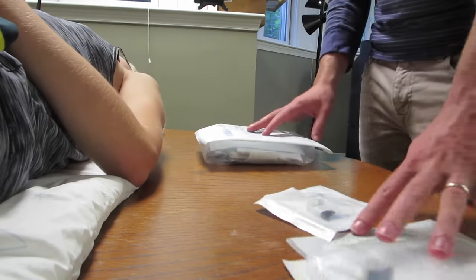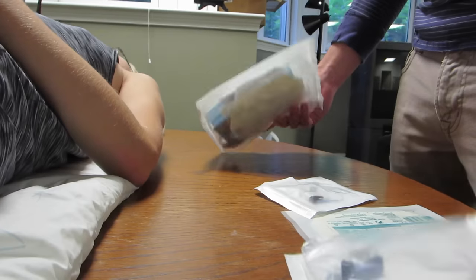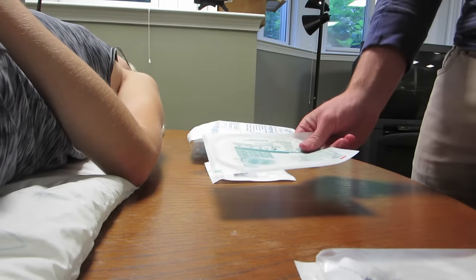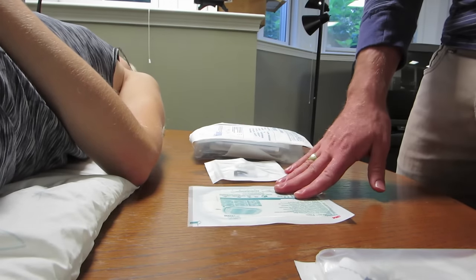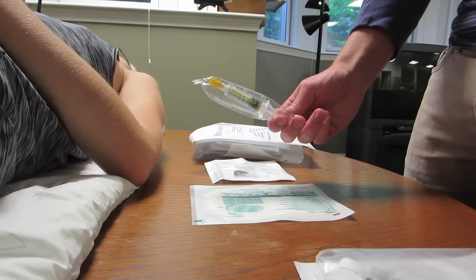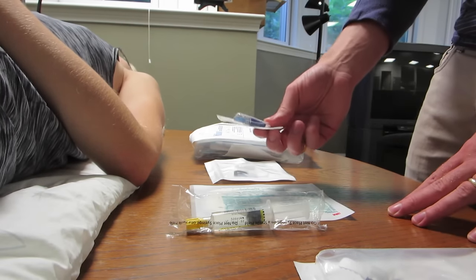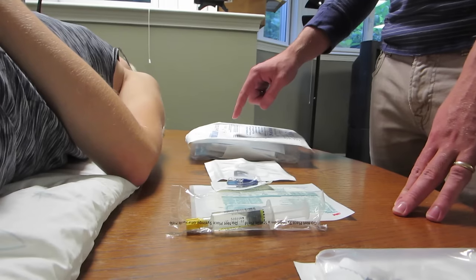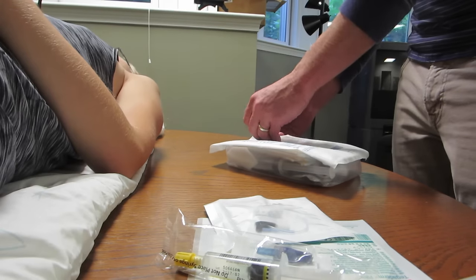After you have your surface all ready and Mary is in place, make sure you have all your supplies. We have a dressing change kit, a needle, and a tegaderm. Often the dressing change kits come with a tegaderm but Mary has one she likes. Right now we're doing a flush, so we have some heparin and a cap for the line. There's also saline in the dressing change kit — if yours doesn't include saline, have that ready as well.